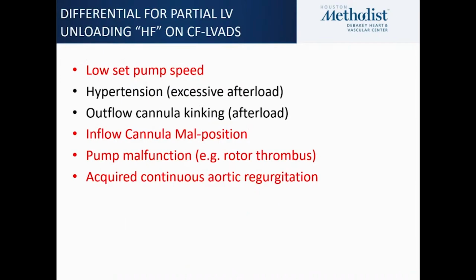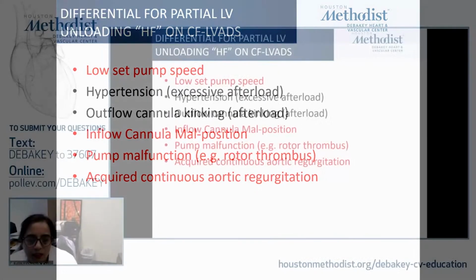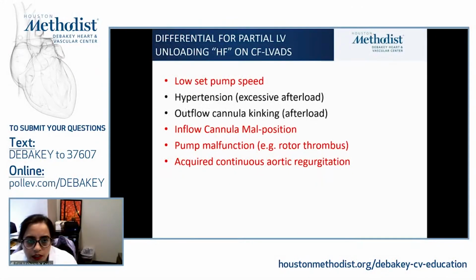When we do see somebody who has a partially unloaded LV, then we have to go through the differentials as to why they have partial unloading. So the first obvious question is whether they have low pump speed. Definitely in that situation, you would want to increase the pump speed, and that would be your obvious answer.